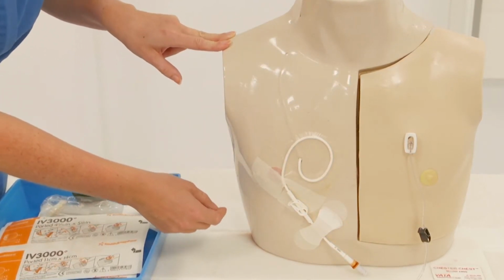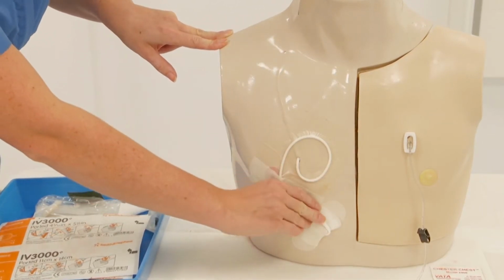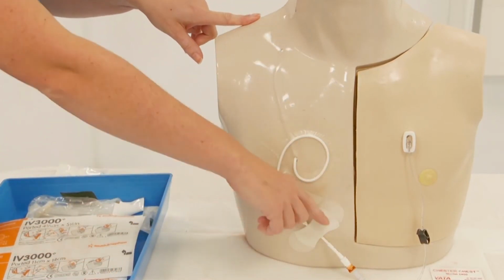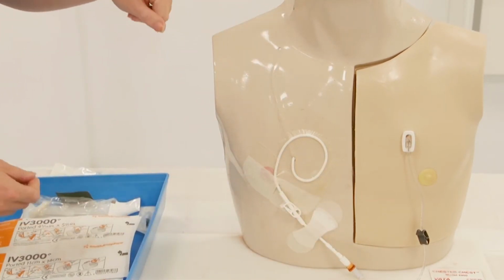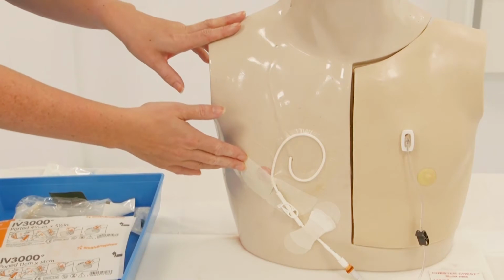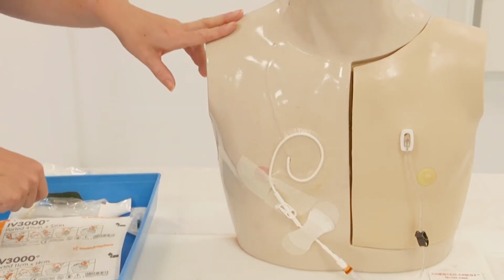You may find that in smaller children, the lines are coiled up the other way, and that's just to stop them dangling in the nappies as well. The other thing that you might also see is that they have wiggly bags across the bottom of them. These are cloth bags that hold these in place to stop them getting dirty. With the Port-a-Cath, it would have exactly the same dressing across the top of it. So you can use dressings for either of the lines that you have.